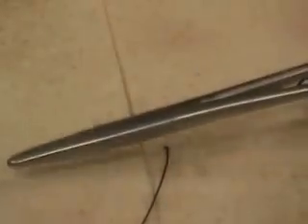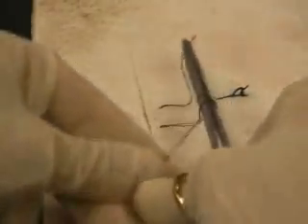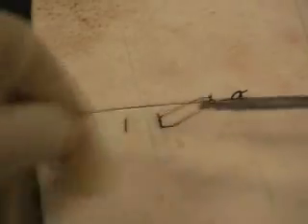We'll drop our forceps down. Now what's different here is before we were always parallel with the wound with our instrument. Now we're going to be perpendicular with our wound, and the reason for that is we're just trying to go in between our suture ends. So you can see I'm in between my suture ends if I'm perpendicular with the wound, and everything is the same. So we're just going to go over 2 times. We're going to grab the end, and now they trade sides, but they're coming this direction, so that's parallel with the wound. And we go in between over 1 time, grab the end, and trade.